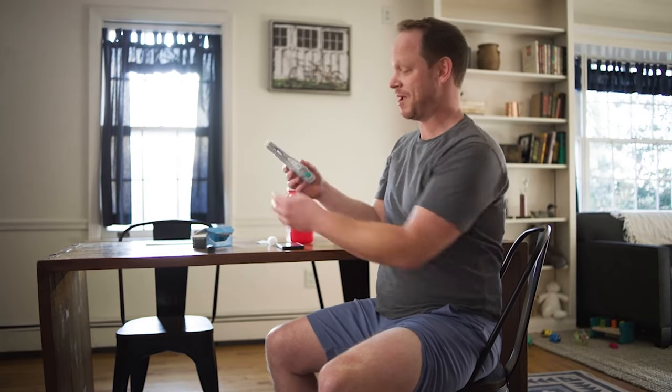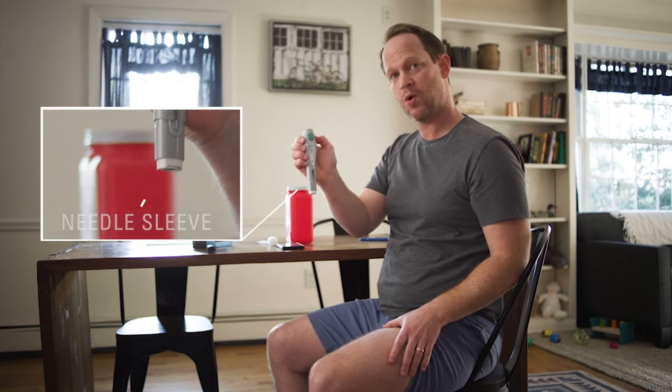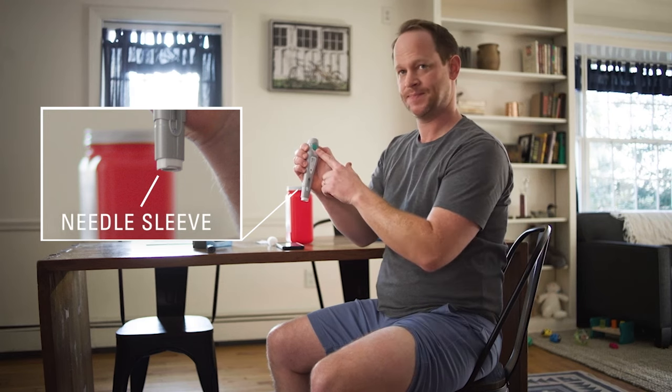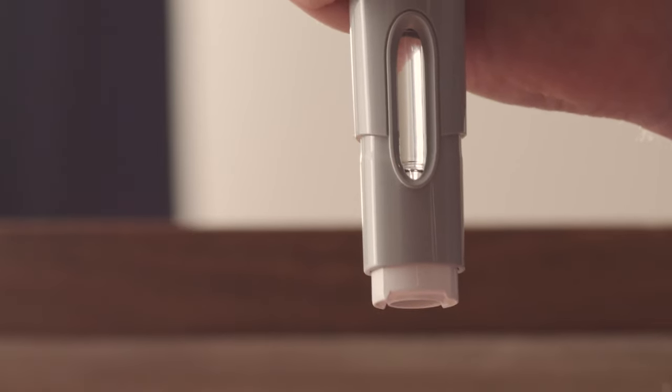I hold my pen with my fingers on the gray grips and turn the pen so that the white needle sleeve points toward my injection site and I can see the green activator button. I also make sure that I can clearly see the inspection window while I'm injecting. I gently squeeze my skin at my injection site to make a raised area and hold it firmly.